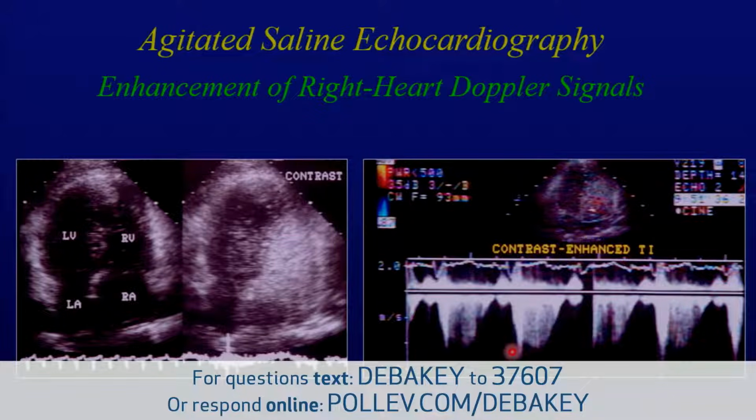Again, because you are depending on the right atrial pressure being a little higher than the left, and you could induce that with a Valsalva maneuver if it is not present at rest, which you cannot do as well with a transesophageal. So we use transesophageal to delineate where the shunt is, assess the size of the PFO, et cetera, but it's not your major diagnostic screening for patent foramen ovale.